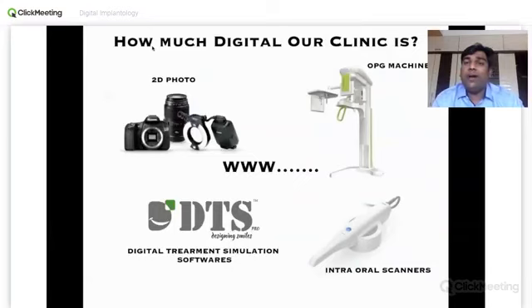So how digital is our clinic? If you look, we have 2D photographs. We have an OPG machine. Many clinics have an OPG machine. Designing software like DTS, just go through that website, digital treatment simulation software, where you can just click a few photographs, tell the patient to sit outside the clinic, and you can make the smile design for them. You can call them in again and show them how beautiful they can look after the digital treatment simulation.